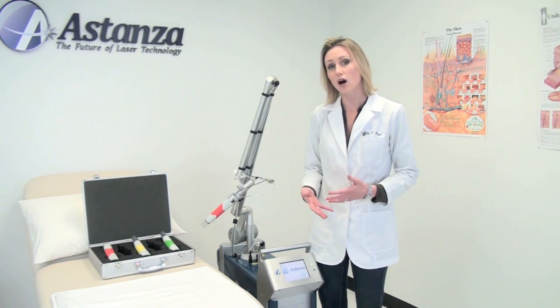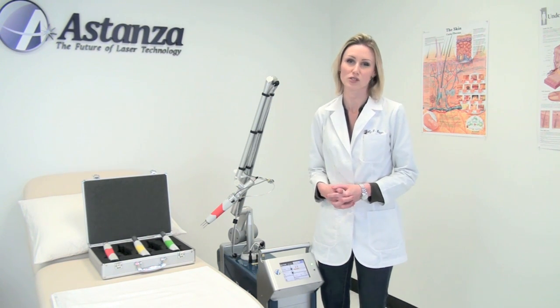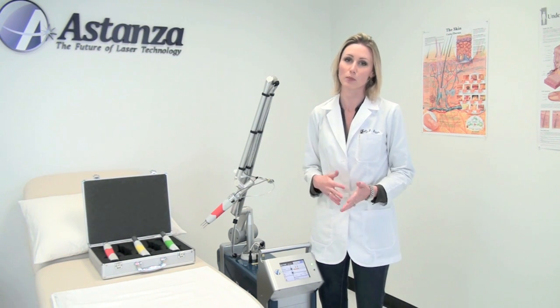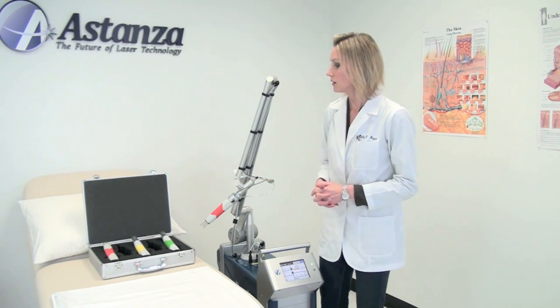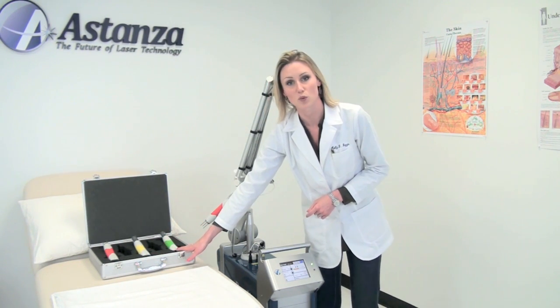Our laser does offer a square spot, which helps with minimizing overlap for patients, which also helps with darker skin patients to alleviate hypo and hyperpigmentation risks. We do have the 3-millimeter, 4-millimeter, and 5-millimeter spot sizes to work with.